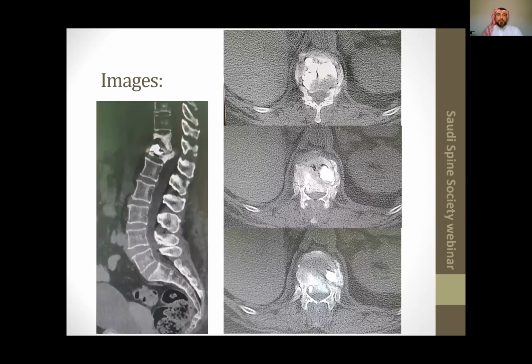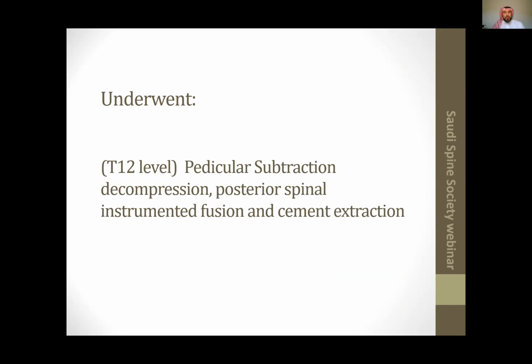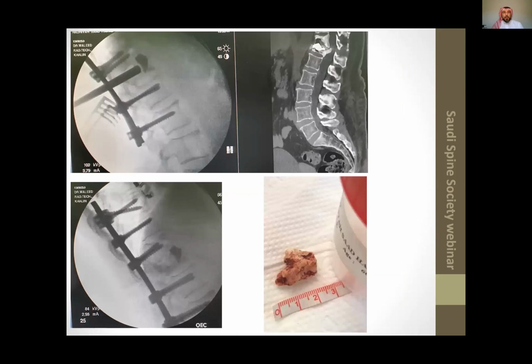For the sake of time, as we're running late, this patient presented in private practice. She has limited insurance, and we cannot do an extremely extensive procedure for her. So we elected to do the T12 pedicle subtraction decompression and transpedicular decompression, posterior spinal instrumented fusion, and cement extraction.